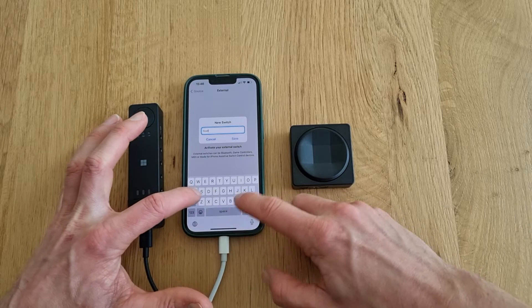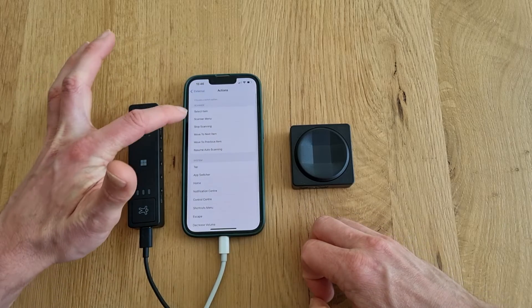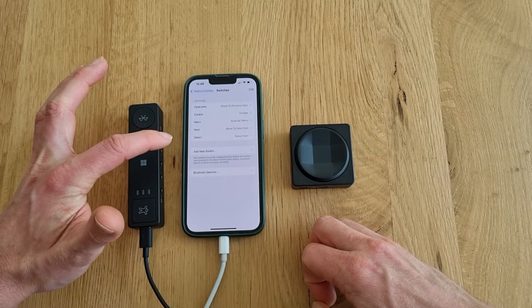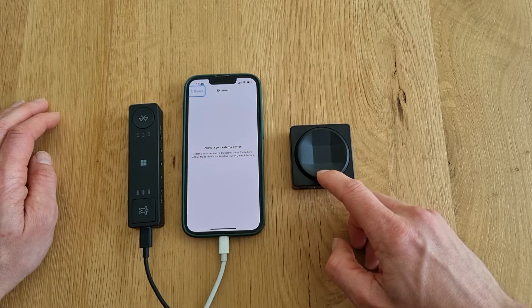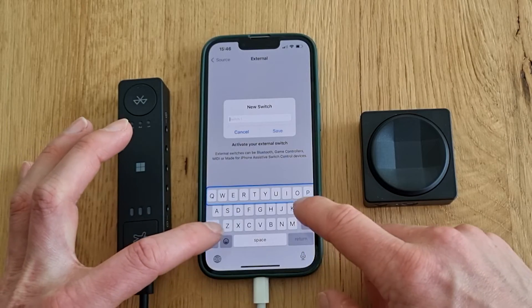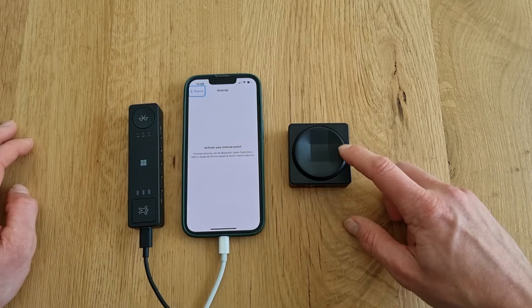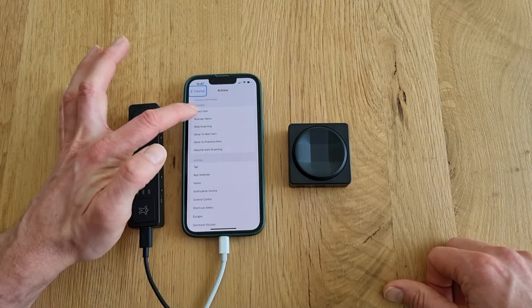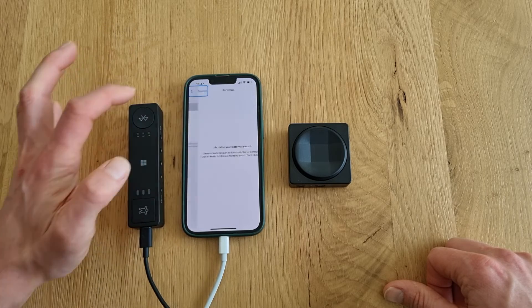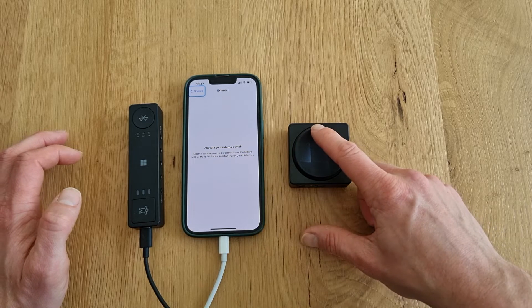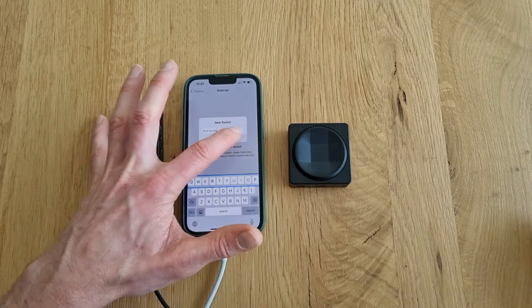For now I'm just showing you one adaptive d-pad button here. I'll set the d-pad up button to Move to Previous Item. I'll then add the d-pad down button and assign Move to Next Item to it. And I will repeat this process for the d-pad right button — in this case to Select an Item. And same as setting up long press for the external switches through the hub, you can do the same for the d-pad if you wanted to, as long as you configure the long press in the Microsoft Adaptive Accessory Center first.